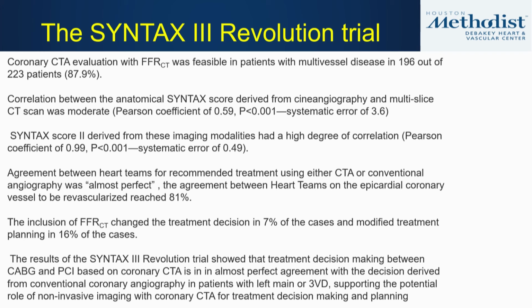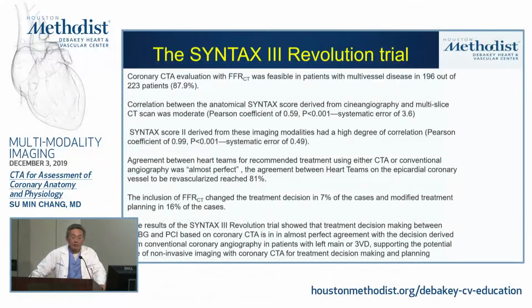Essentially, they have patients who all have multivessel disease, need to go to bypass surgery, and they also have CTA. So they have a heart team of cardiology and surgeon review the CTA only and an invasive angiogram, okay?